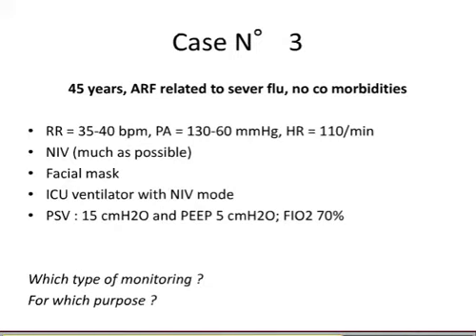Everybody is okay with saturation, continuous monitoring. It will be essential when you... If there is already a central venous line in, central venous saturation may be very helpful. Yeah. Central venous saturation.